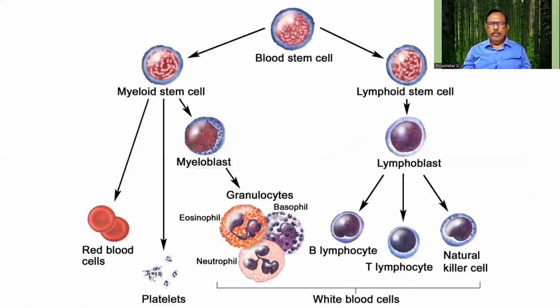The cells we people should be knowing. This is one, a stem cell, and then there is a committed stem cell. There is a myeloid one, wherein you get the myeloid series, and then sometimes the granulocytic, erythroid, monocytic, and megakaryocytic series can be together. Therefore, there can be an erythroid coming out of it as well as the megakaryocyte. Finally, you find that the lymphoid cells are totally different. That is why you find that the lymphocytes and the plasma cells will be unaffected in the case of aplastic anemia.